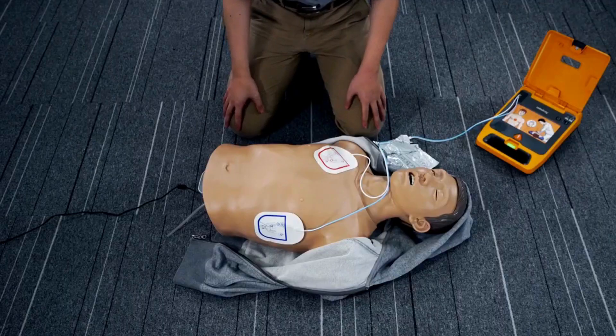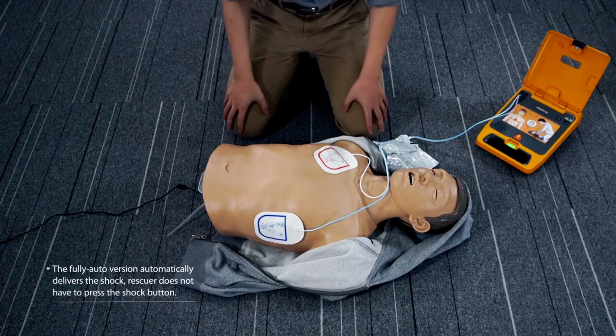Do not touch the patient. Analyzing heart rhythm. Shock advised.